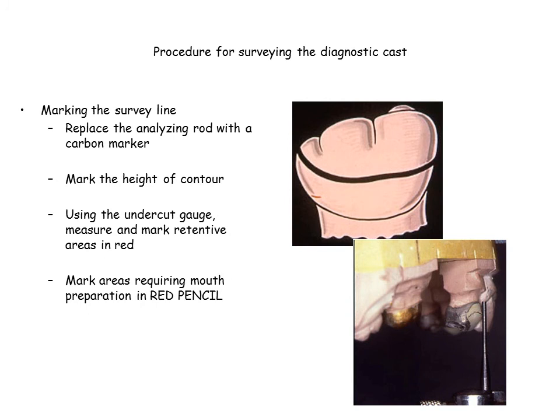56. The final path of placement will be the antero-posterior and lateral position of the cast in relation to the vertical arm of the surveyor that best satisfies all four factors — that is, guiding planes, retention, interference, and aesthetics. 57. Replace the analyzing rod with a carbon marker. 58. Mark the height of contour. Using the undercut gauge, measure and mark retentive areas in red. 59. Mark areas requiring mouth preparation.